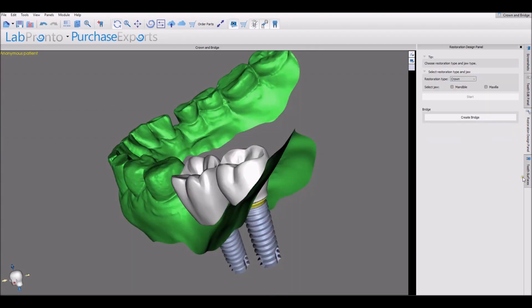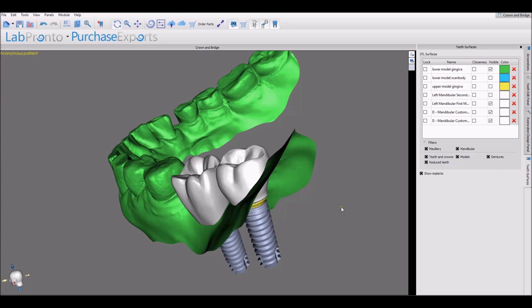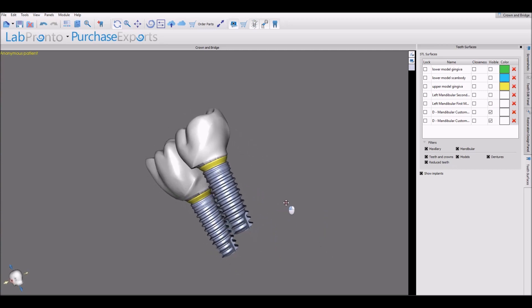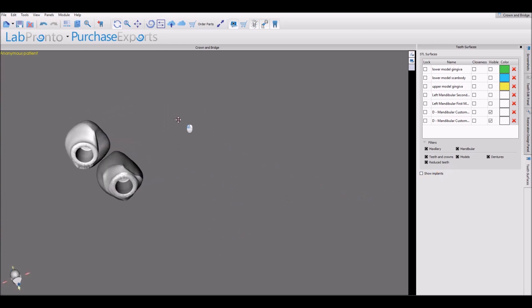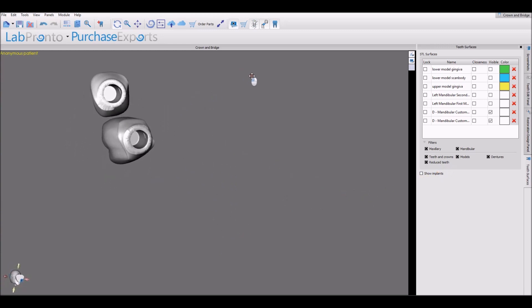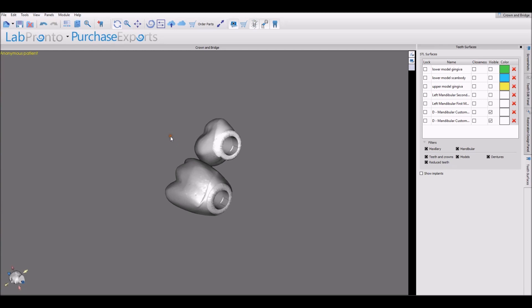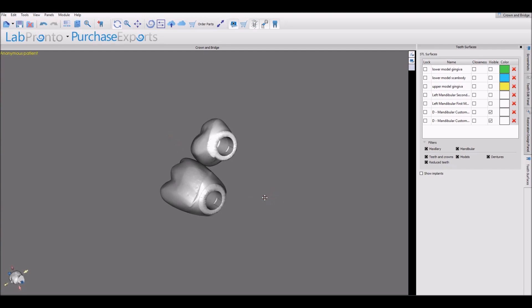We can now see our two designed crowns. The original crowns still appear in the surfaces list — if you want to redo the design, just delete the new crowns and repeat the process. And we have our two crowns ready for export.